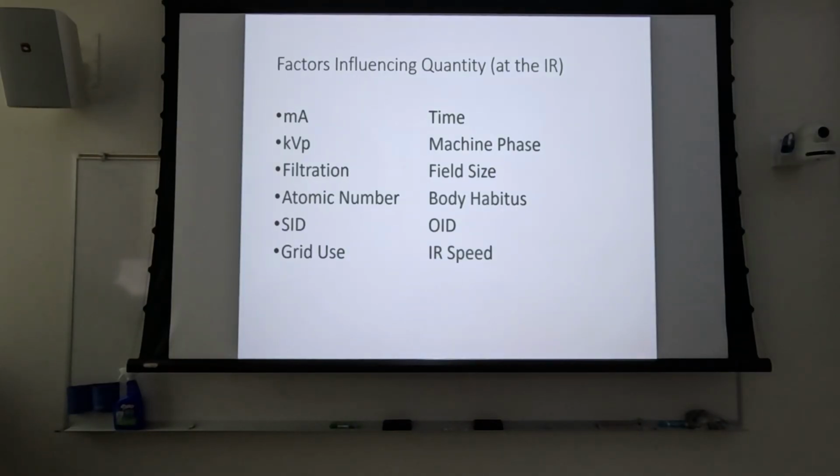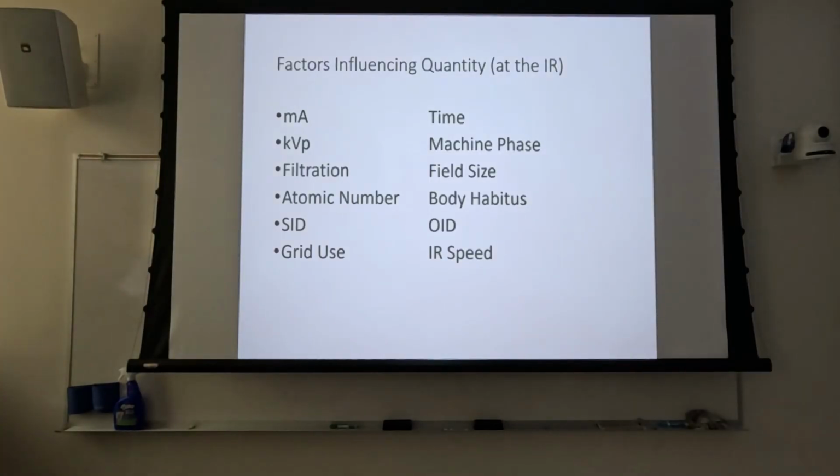So kVp, if you had a chance to review the three-part series I did last year on kVp, this should sound familiar. I mean, it's 2.5 hours worth of nothing but kVp, but it's pretty comprehensive. So kVp, you know that it's the most significant factor. It controls your exposure more than anything else. But we call it an influencing factor because as of yet, it's not what we use to control image receptor exposure. It's a secondary factor. We still use mAs to control exposure, and it's still testable.